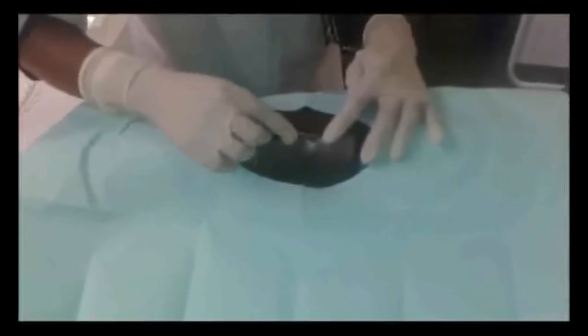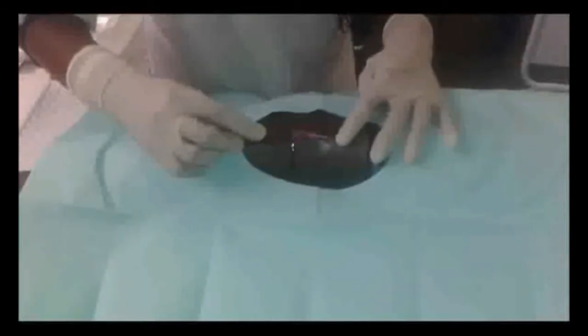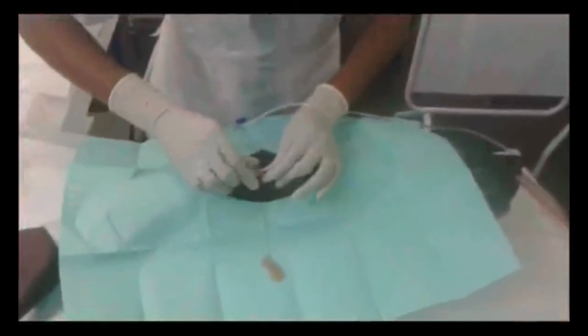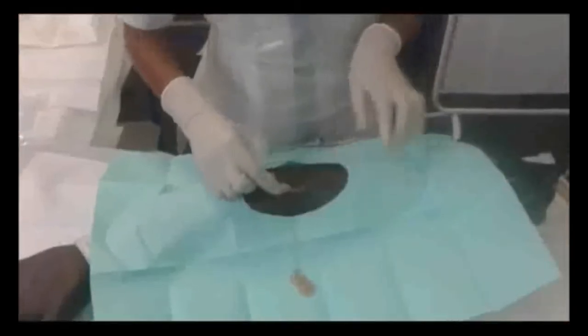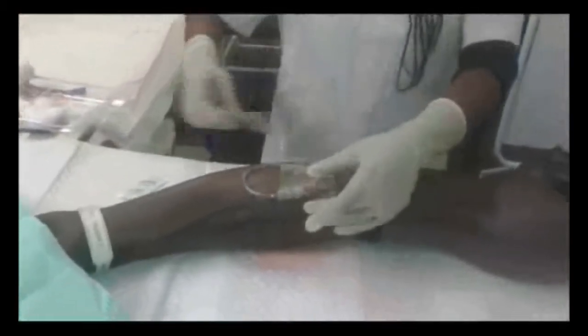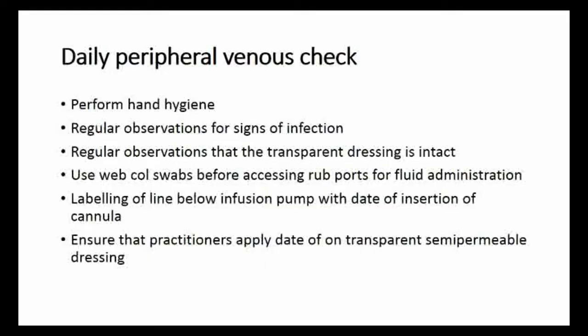Try to remove the needle safely. Most needles should have a safety mechanism for this, at which point you would discard your needle into your sharps bin. You should now quickly insert the bottom end of the drip. When this is done, you will need to secure your cannula using a transparent opsite. And that is how you insert the sterile IV. Be sure to thank your patient afterwards and clean up after yourself.